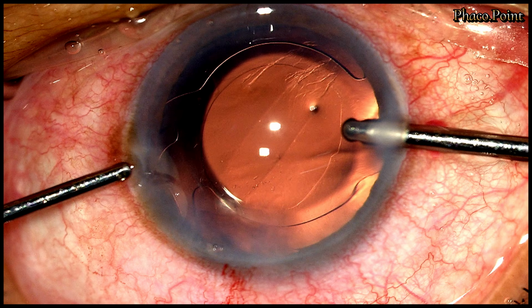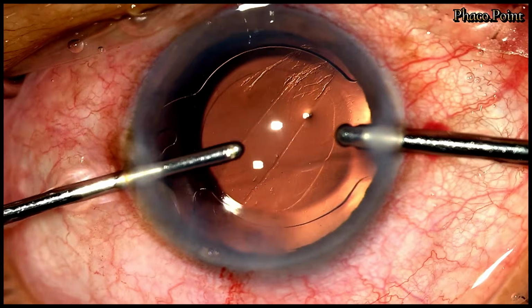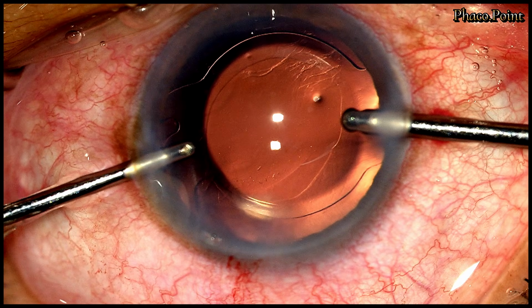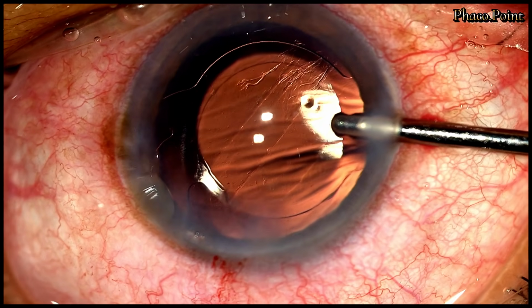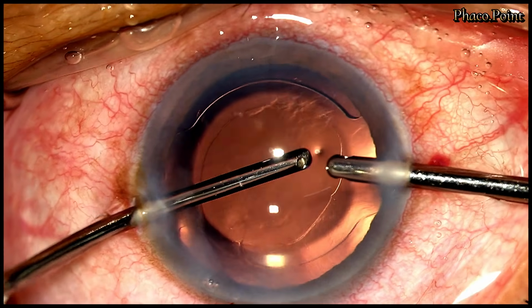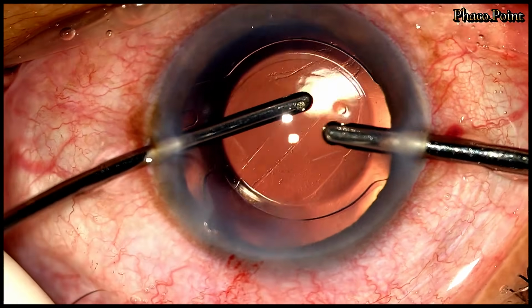Upon looking closer, you will realize that these folds are in line with the midpoint of both the haptics. Let's proceed with the visco wash. When we push the IOL posteriorly with the help of the aspiration cannula, as you can see here, the folds vanish. Once more, when the chamber shallows a little, the folds reappear. This is what you will see in this part of the video. Clearly, the haptics of the implanted intraocular lens are stretching the bag asymmetrically at its midpoint.